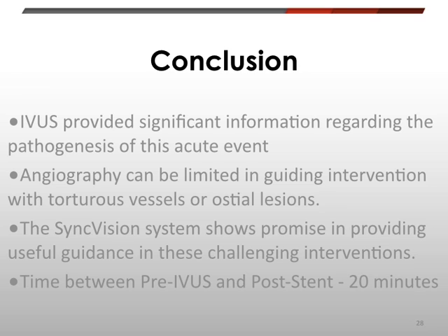What I think was especially interesting is, despite the complexity of this case, from the time we did the initial IVUS to the time we went post-stent, the whole procedure took 20 minutes from IVUS to IVUS. And that is not a long time to do something this complex and get this nice of a result. So overall, we're very pleased with what we've seen so far.